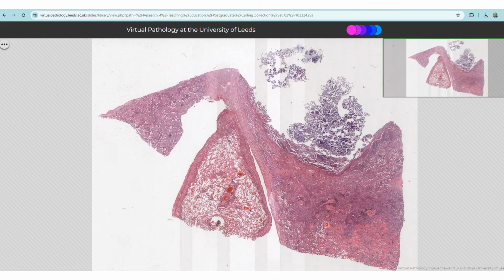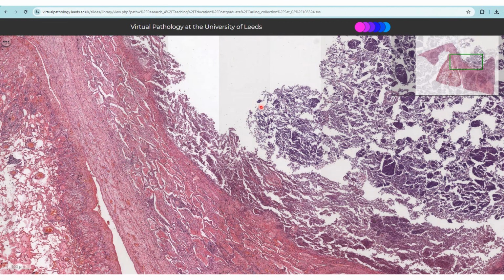And the last one is bronchiectasis. This is a tissue of the lung, and you can see there's something there. This is destruction of the whole alveolar parenchyma, because this is supposed to be a bronchial wall. There's supposed to be a bronchus there, but it got destroyed, and these are the bacterial colonies, and there's a lot of necrosis there and there. This is all necrosis because there's no tissue left, and this is infiltrated by neutrophils and forms what we call an abscess. Alright, that's all.